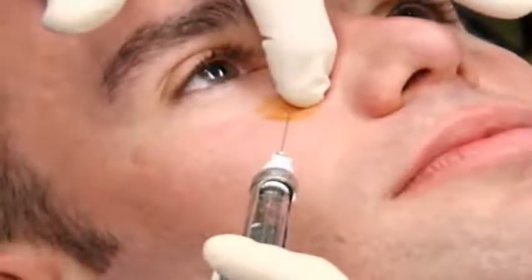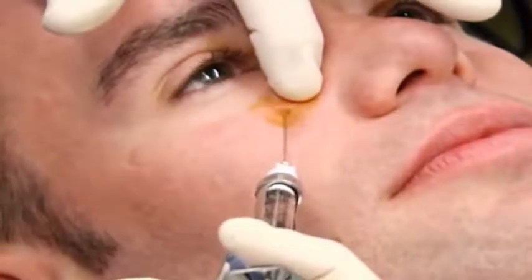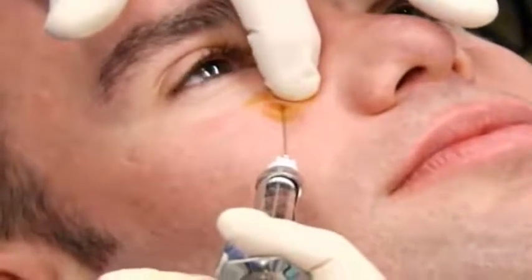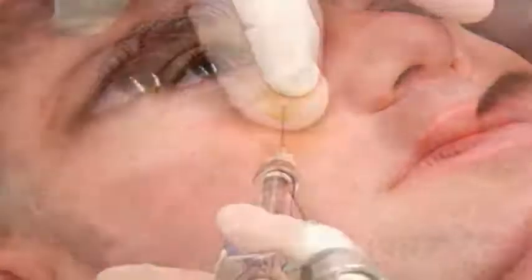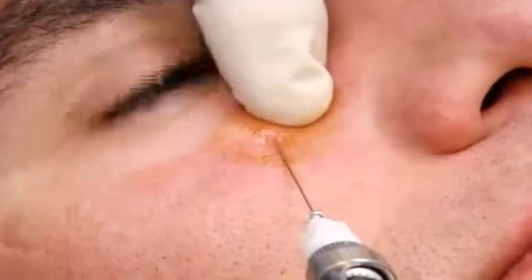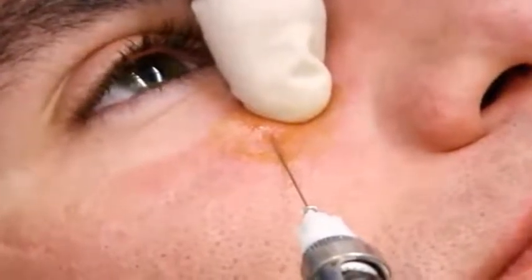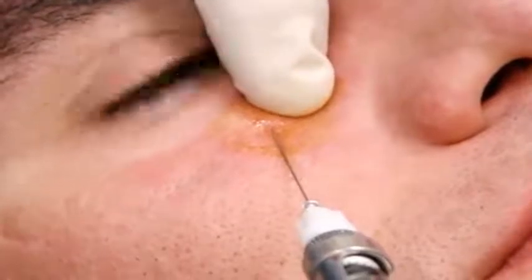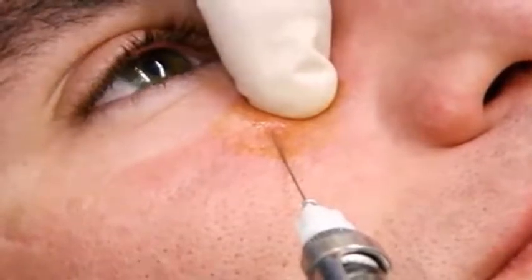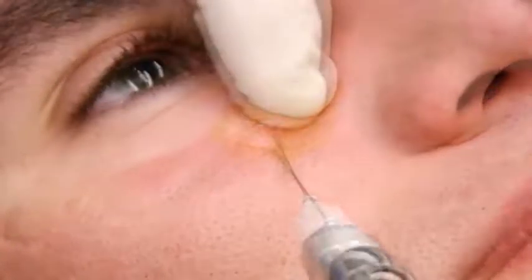With the finger in position, insert the needle a slight distance into the subcutaneous area and inject very slowly. This requires about 1/3 of a cartridge of anesthetic. Be certain that the tip of the needle contacts bone in order to deposit the anesthetic solution immediately adjacent to the foramen and not into the epidermis.